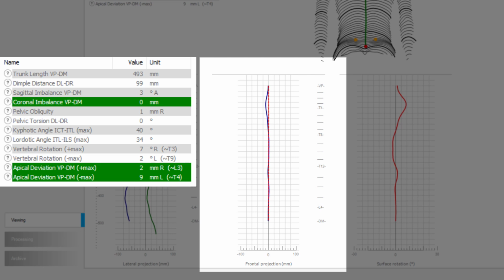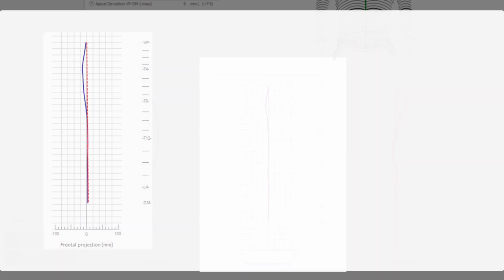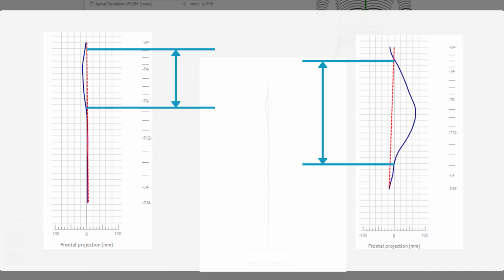Of course, it makes sense to look at the values of the maximum deviations, but subjective impressions can also help to deepen knowledge here. So is the deviation short or long-arched? The former can possibly speak for short-term postural reactions like blocking or evasive postures. It should be emphasized that sharp changes in direction in the course of the curve can have a high stress potential for the underlying structures. An elongated curve is more likely to be found in longer-acting full-blown compensations. For example, more advanced scoliosis is more likely to be measurable by the deviation extending over a larger segment.